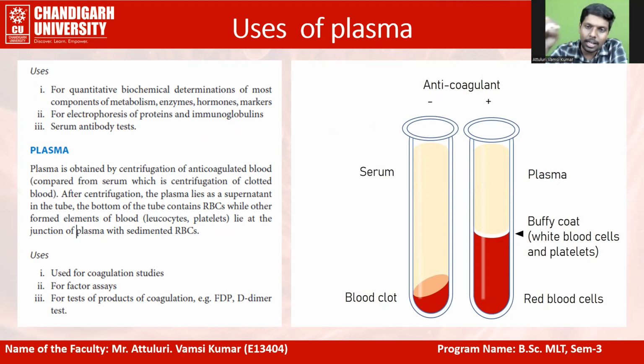If you want to go for analysis of any white blood cells, then we will take the smear of this Buffy Coat and we will go for differential count of various white blood cells. So that is the significance of this Buffy Coat.